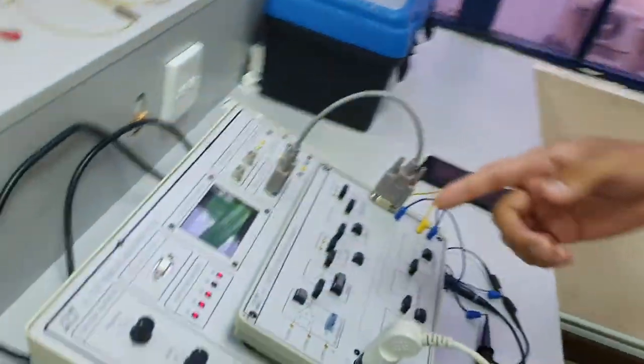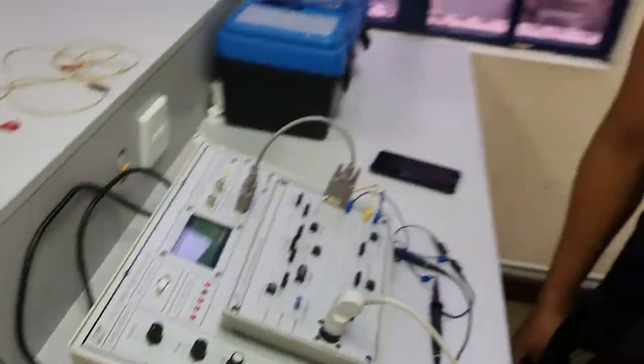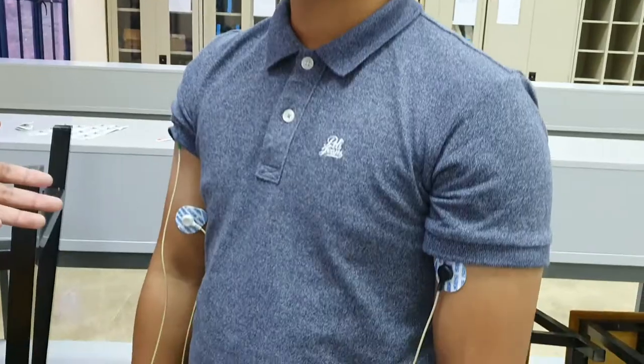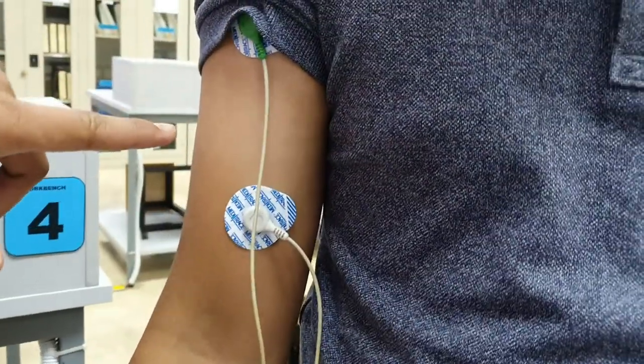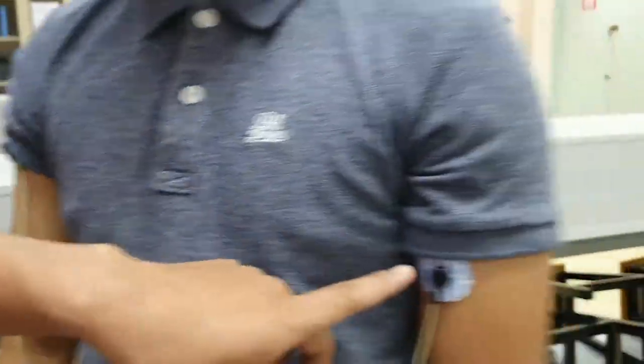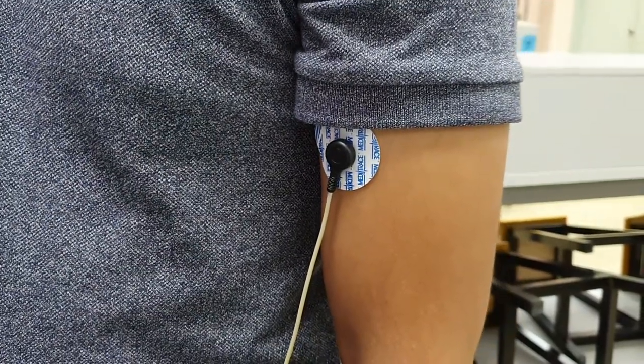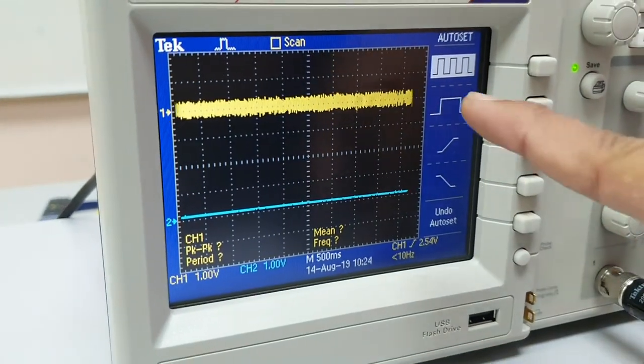Hi, assalamualaikum and good morning guys. Today we would like to make one experiment called EMG measurement. EMG stands for Electro-Myogram. For today we have a KL72001 EMG module. For our subject, we use three electrodes located at the lower muscle and the upper muscle, and this is for channel 2 as the reference, and channel 1 uses two electrodes.